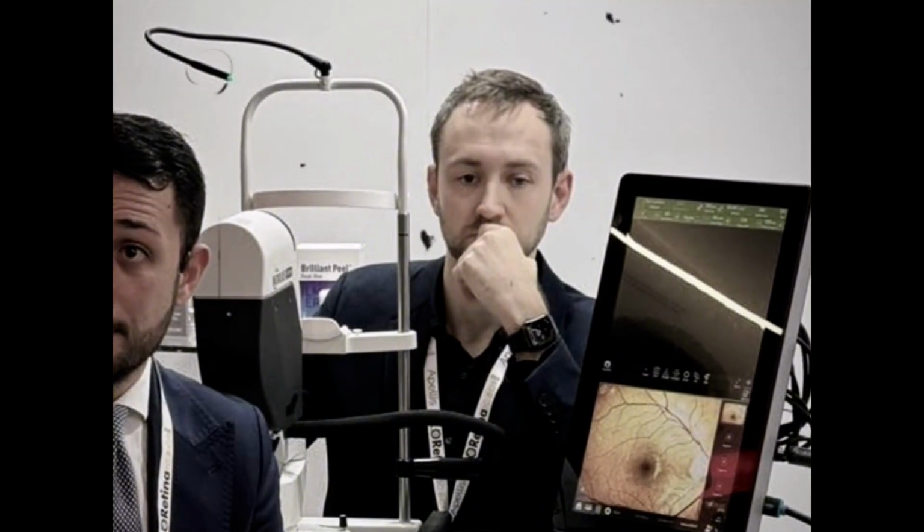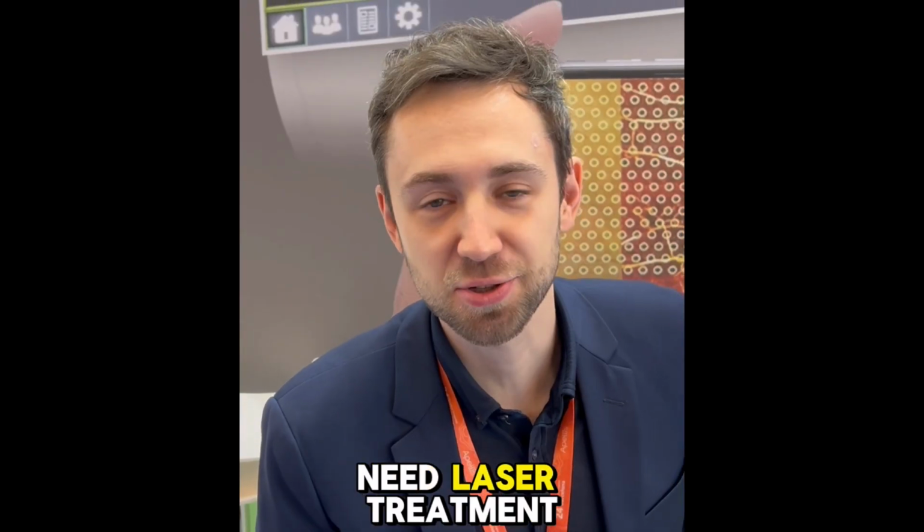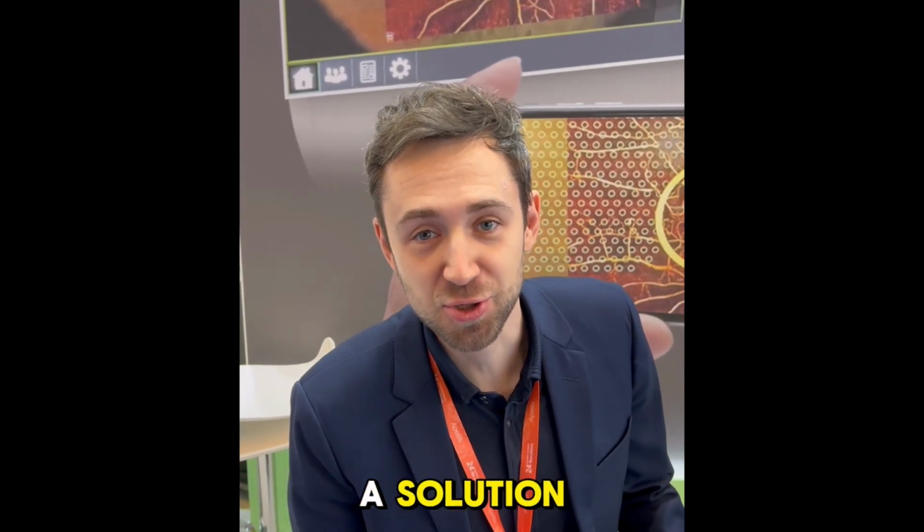Sometimes, even the most experienced retinal laser surgeons need laser treatment. Now there is a solution.